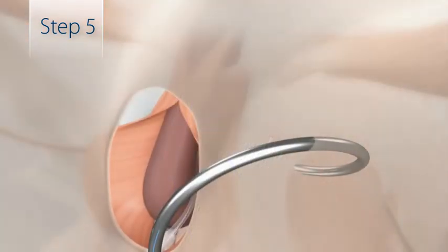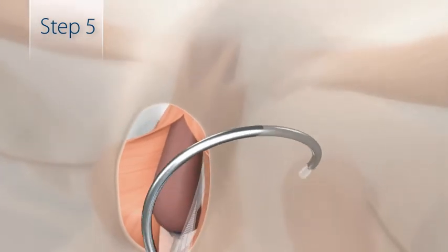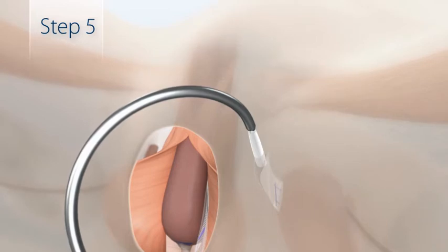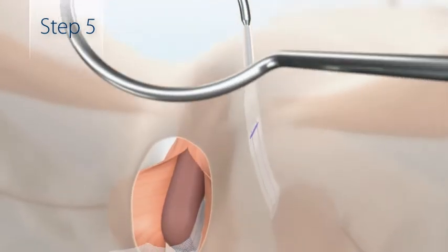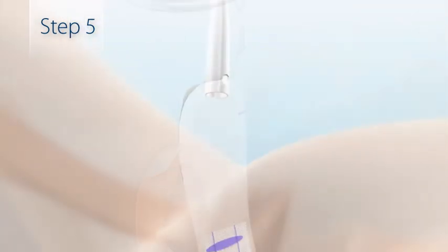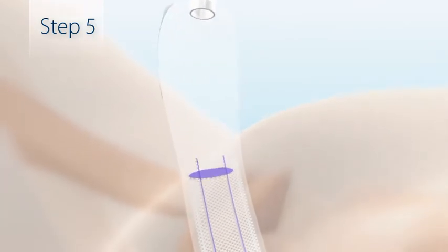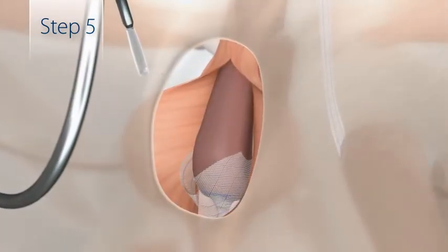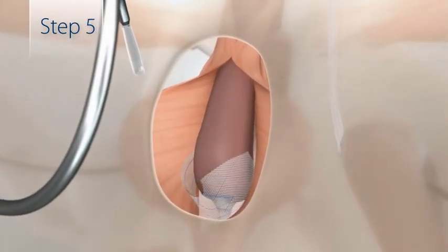Once connected, pull the sling out the stab incision by rotating the needle back along the insertion pathway. Pull only enough to bring the center of the sling to the patient's midline. Cut the sheath and mesh below the blue mark on the end portion of the plastic sheath. The needle passage and sling connection are now repeated on the patient's contralateral side.